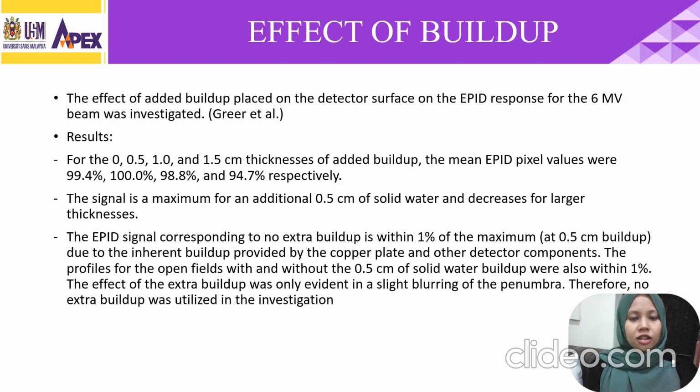The effect of added buildup on the detector surface on the EPID dosimeter response for the 6 MV beam was investigated. This was done in order to determine whether added buildup material was required for the dosimetry to be accurate. Therefore, the results of these investigations were explained.